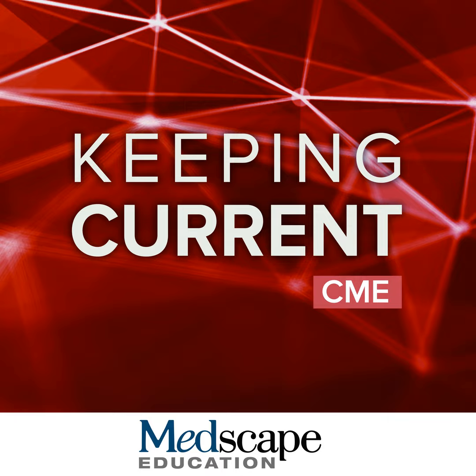The other thing that is new and important is structured reporting. So I highly recommend you build out templates, and these are also available through the ASNR for these MRI scanners, calling out specific things like the field strength, the technique that was used to identify the microhemorrhages or siderosis, grading the white matter hyperintensities with a standardized scale, quantifying these small, large infarcts, microbleeds, et cetera. So all of these are criteria that are needed for therapy and are needed for monitoring.